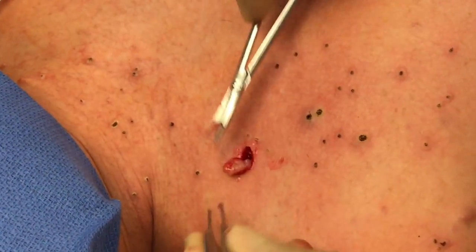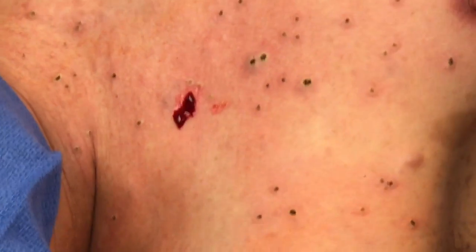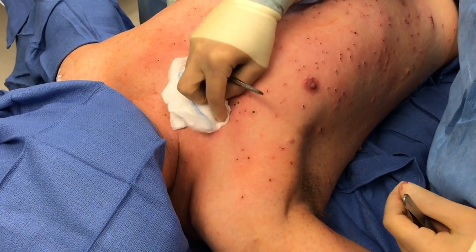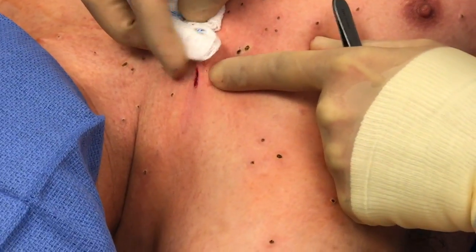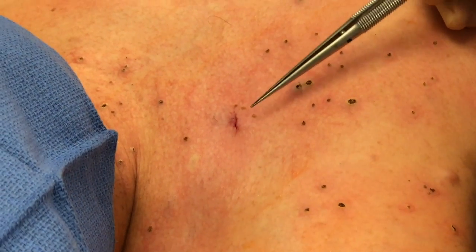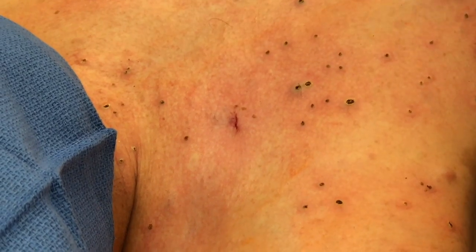We're able to remove that from a deep level, and then we go ahead and close this up with stitches to get that into a linear closure. And that's the final closure of the excision of that particular skin tumor.